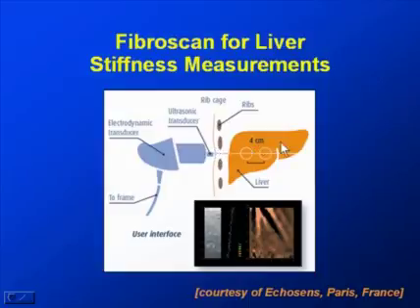skin, and this pressure wave will travel through the ribs, and you essentially get a measure of differences in propagation velocities converted into Young's moduli, so that you get a measure of how the liver is looking and what the disease stage is, because things that change the overall appearance of the liver, such as cirrhosis, could be depicted in this fashion. And at least the initial clinical trial shows that this device should have an accuracy in excess of 95%, which would be very impressive.